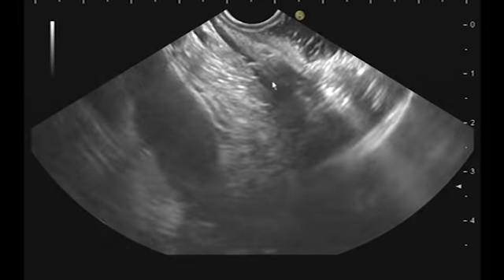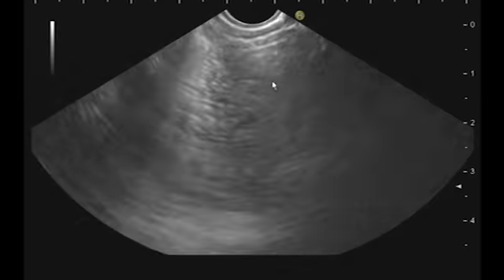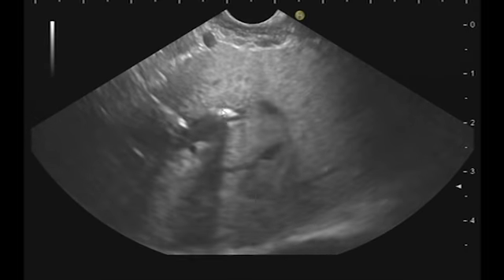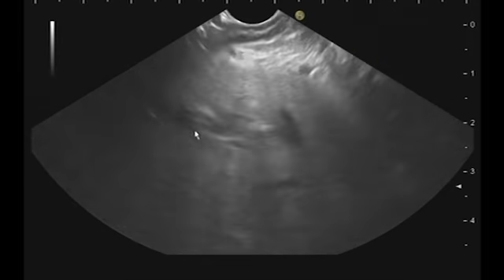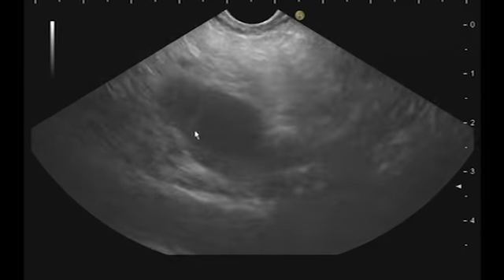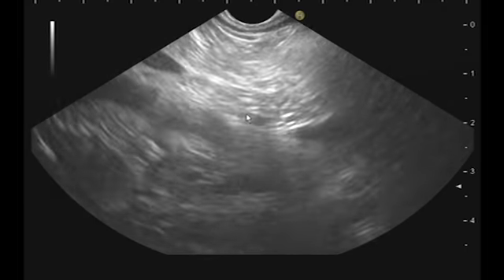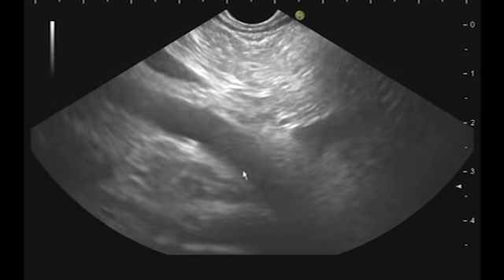Okay, now I think the next step is to do a complete examination transgastrically. This is the left lobe of the liver with some dilatation of the duct. There is some air inside, and the ducts are dilated here. And this is due to the obstruction of the plastic stent. This is the pancreas. There is no dilatation of the main pancreatic duct here. This is the confluence with the superior mesenteric vein, also free, and the superior mesenteric artery, which is here, it's also free. There is no contraindication for surgery.